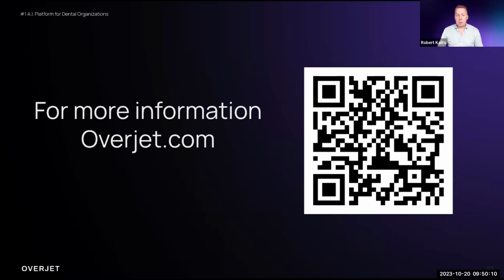For panoramic images, we do tooth identification, we do third molar impaction detection. What we don't do right now is any pathology, your dentigerous cysts or ameloblastomas, things like that. The FDA hurdle to get approved for those models is significantly higher than caries or bone loss detection. So certainly we're working on it and interested in doing it. I think the time frame to turn that around is elongated.